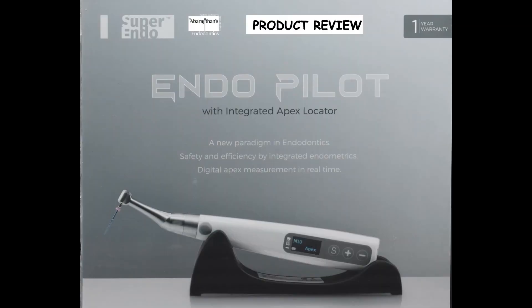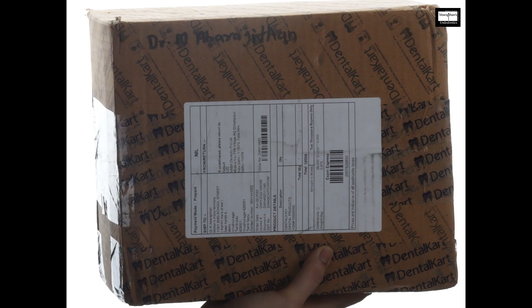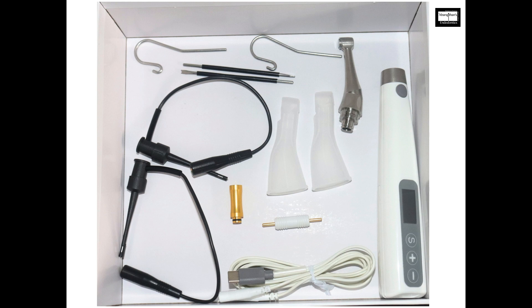This video is a product review of a particular endomotor which makes this function very simple and easy because it does not require any special attachment to the head of the handpiece, but still lets you integrate the Apex Locator with your rotary file. After a search, I narrowed down to this endomotor called the EndoPilot from Super Endo. I acknowledge and thank DentalKart for providing the endomotor for demonstration.